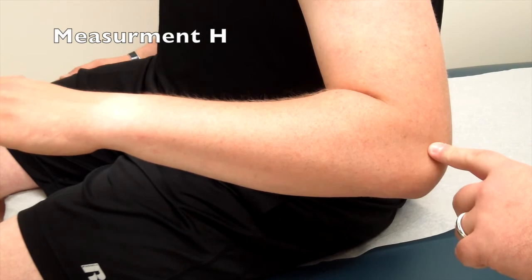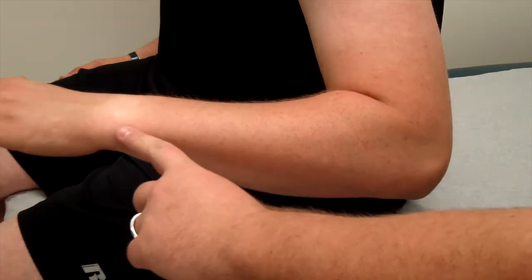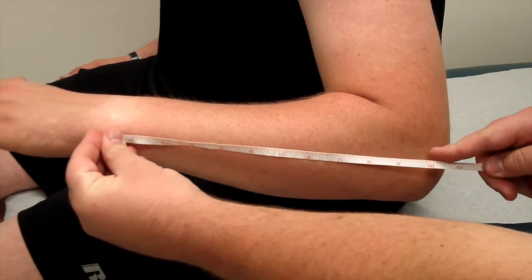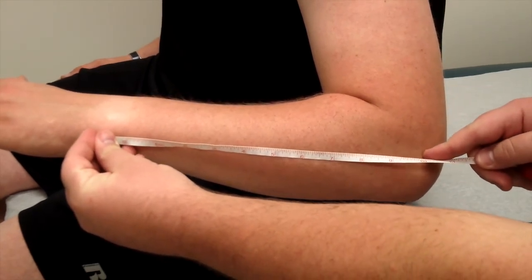Measurement H. Locate the ulnar styloid and the lateral epicondyle. The lateral epicondyle is the bony protuberance on the lateral side of the elbow. Measure the distance between these two points.